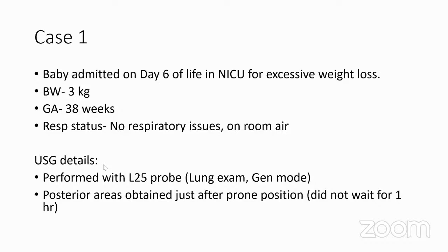So this was a term baby who was admitted on day 6 of life for excessive weight loss. The birth weight was 3 kg and gestation was 38 weeks. The baby did not have any respiratory issue and was maintaining saturation well on room air. So I chose this case to just get an idea what a normal lung looks like.